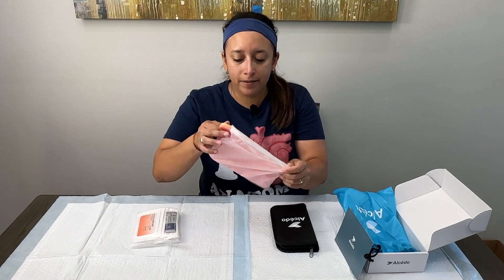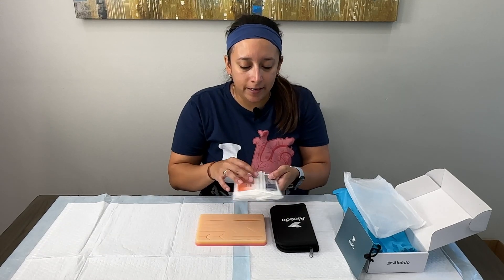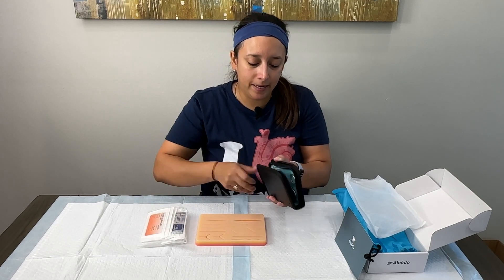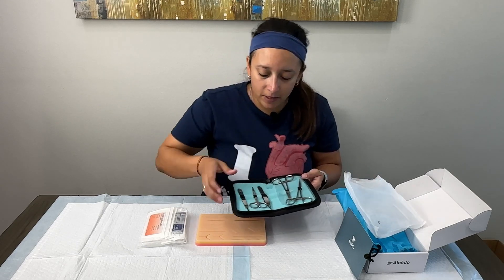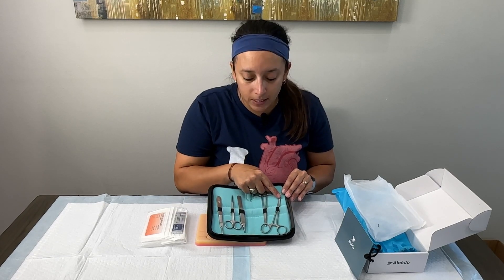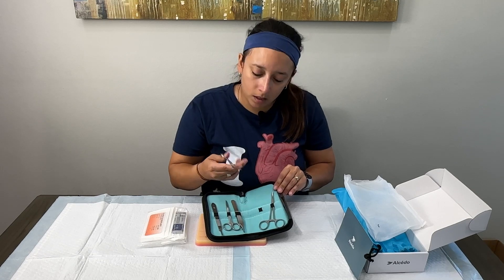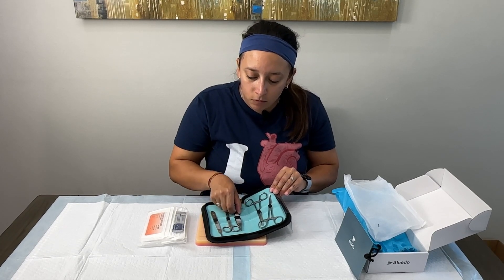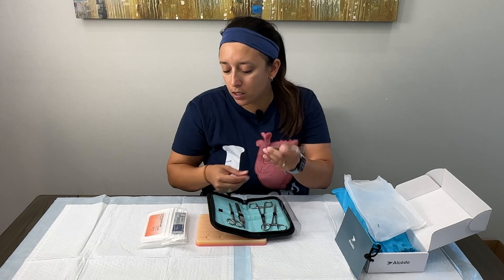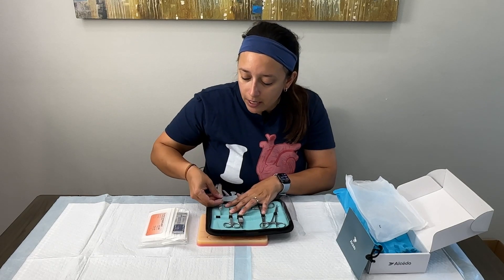Looking inside, we have a kit with all our essential tools. We have our silicone pad, which I'm going to take out, and we have our sutures and a few blades for our scalpel. Inside the kit, there's a pair of curved hemostats, needle drivers that seem to be good quality, rat-tooth forceps, suturing scissors, and a replaceable blade handle for our scalpel blades, plus some scalpel blades included.